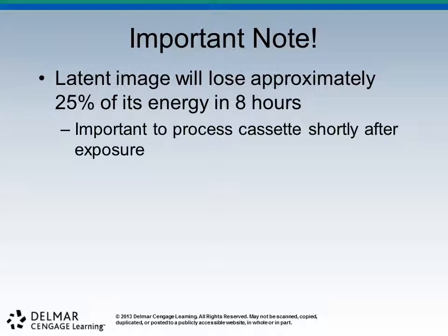We've got to scan them, that is, put them in the image plate reader, within a relatively fast period of time. We can't store them. Used to, you could store film cassettes as long as you kept them away from radiation for sometimes days. It's not the best, but you can. This PSP plate, because they're electrical charges, will lose some of that charge, as this says, up to 25% of it in 8 hours, meaning that we're losing image data.